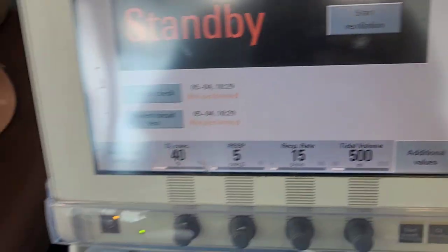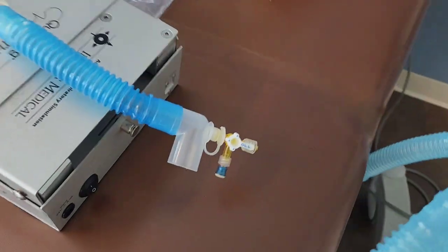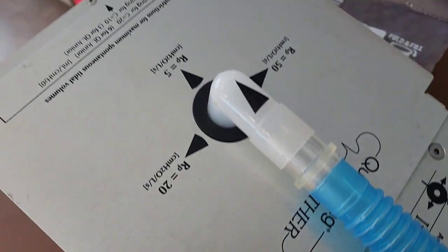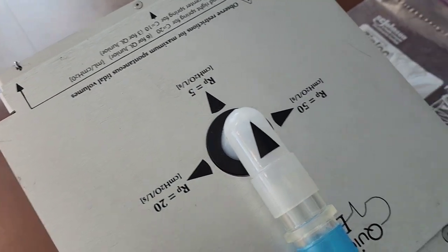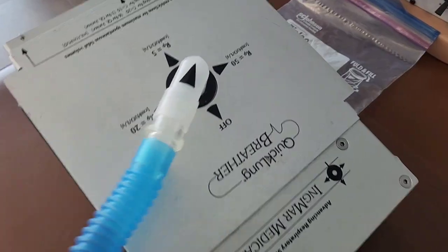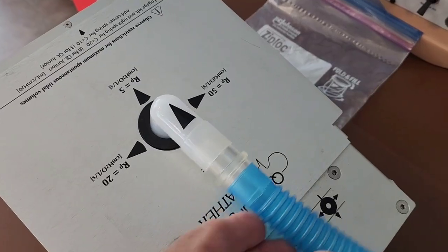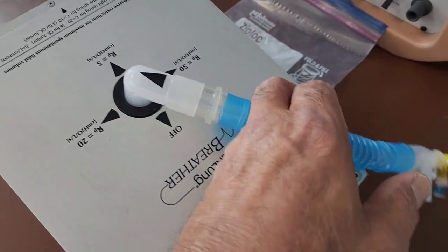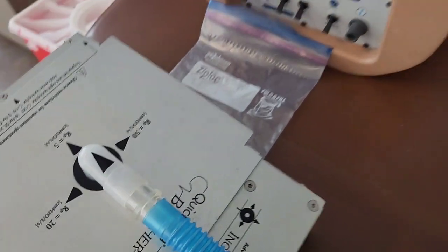Okay. And so I'm going to hook this up to the quick lung breather, and you'll connect it right to here. You want to keep this arrow pointing straight up to resistance of 5, which is normal resistance. And when we check for resistance, we'll be moving it to 50, which is the pretty high resistance, or we can go to 20. So basically that's how we're going to adjust it. So make sure this arrow is pointing up to 5. Okay, let me hook up the ventilator real quick.